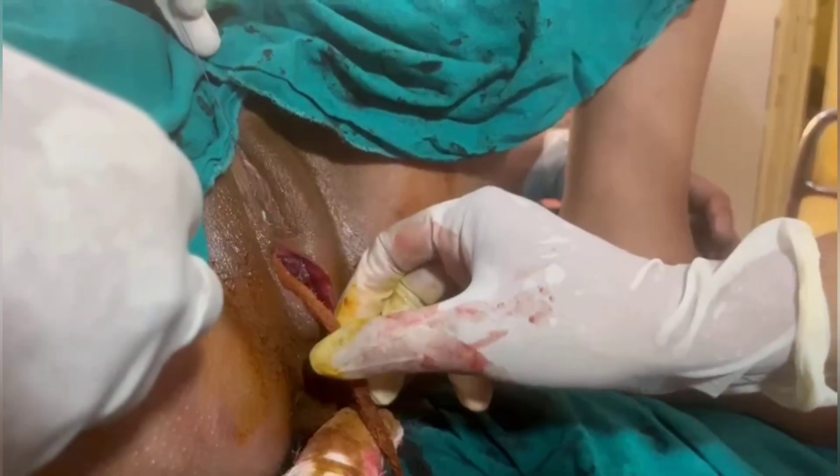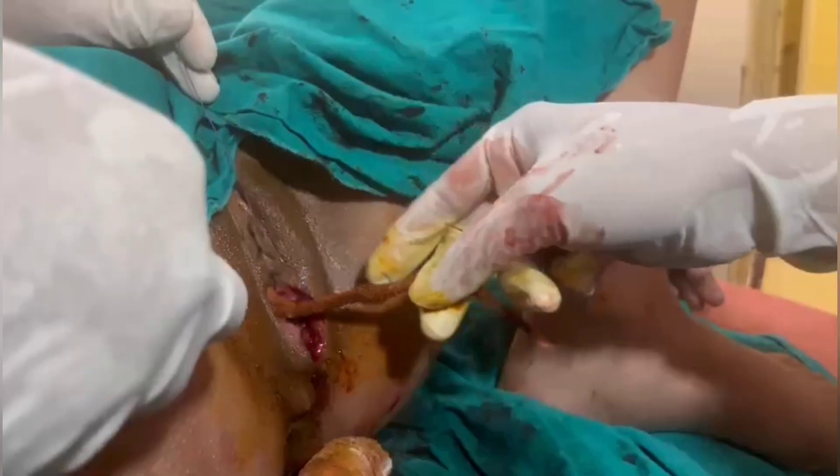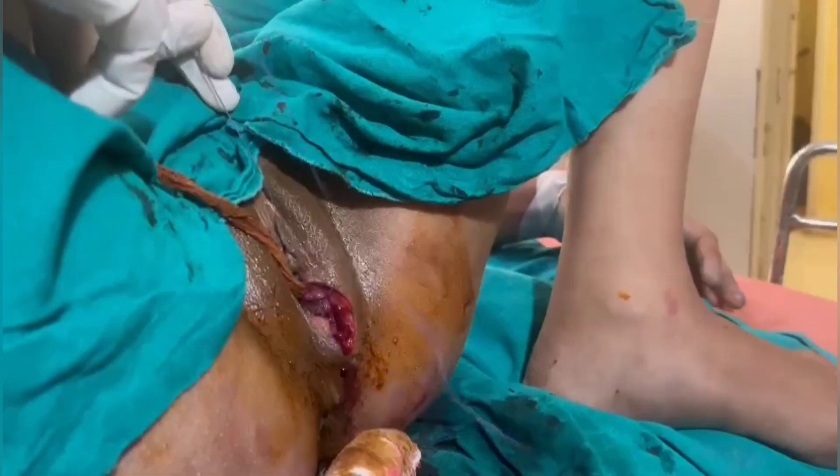I am using Vicryl Rapide. The sausage-type pack is kept in the vagina and the tag always has to be left out. Never forget to remove it — otherwise it will be like a foreign body and it's not good to leave anything inside.